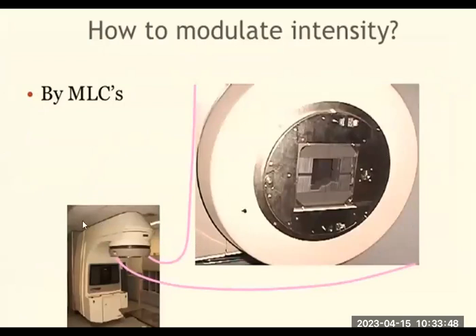You can see the IMRT device in the small diagram on the left-hand side, and that one is a zoomed version where you can find how the collimator looks. So the collimator will be programmed and adjusted so that the beam changes as the gantry rotates around the patient. So that is completely computer programmed.